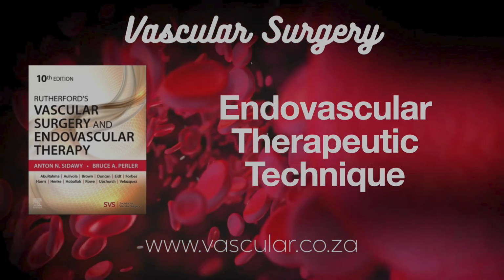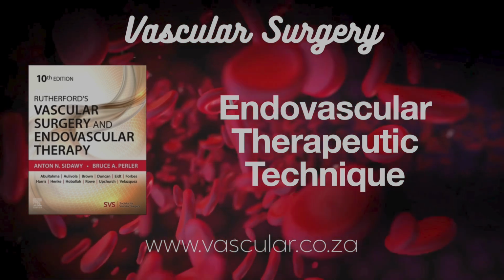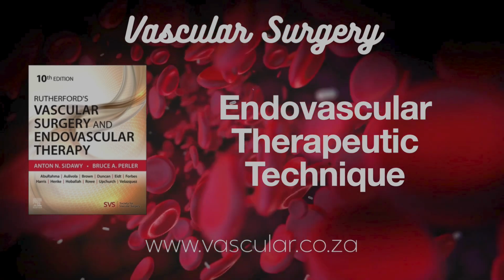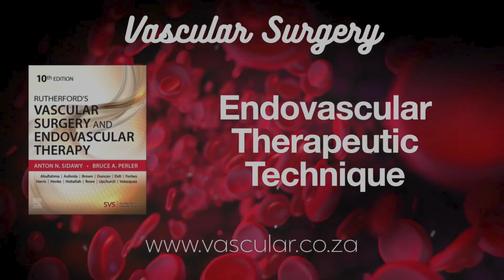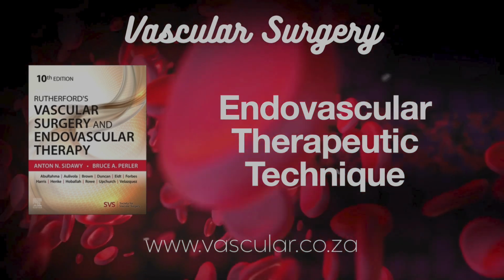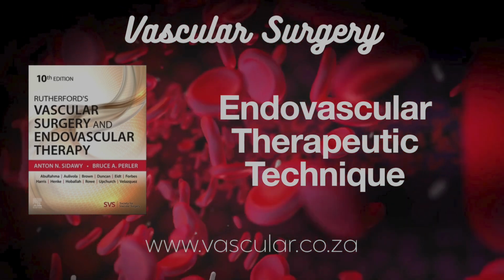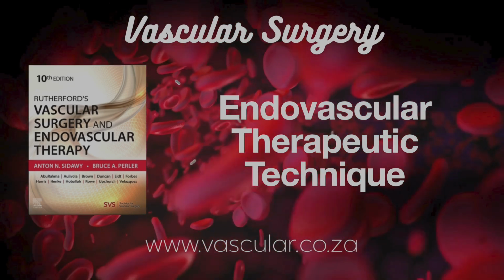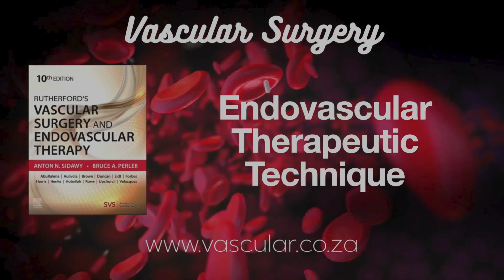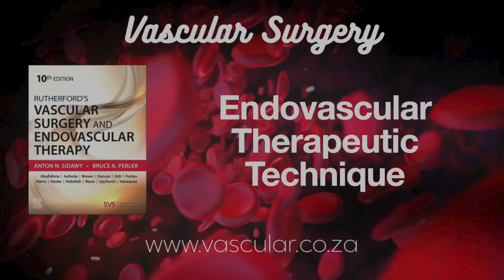Let's start at the beginning with a technique you've probably heard of, balloon angioplasty. Yes, PTA, percutaneous transluminal angioplasty. This was really the first big breakthrough, wasn't it? Treating peripheral artery disease without open surgery. That first percutaneous approach. Dotter and Judkins, 1964. That's right. They essentially pioneered treating blockages from within the vessel. Catheters, dilation, avoided those big incisions. Revolutionary stuff. They started with dilators, progressively larger ones, I think.